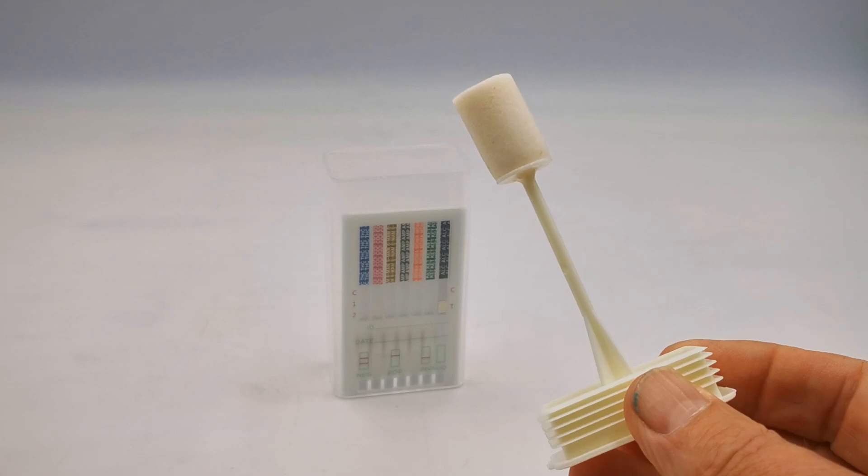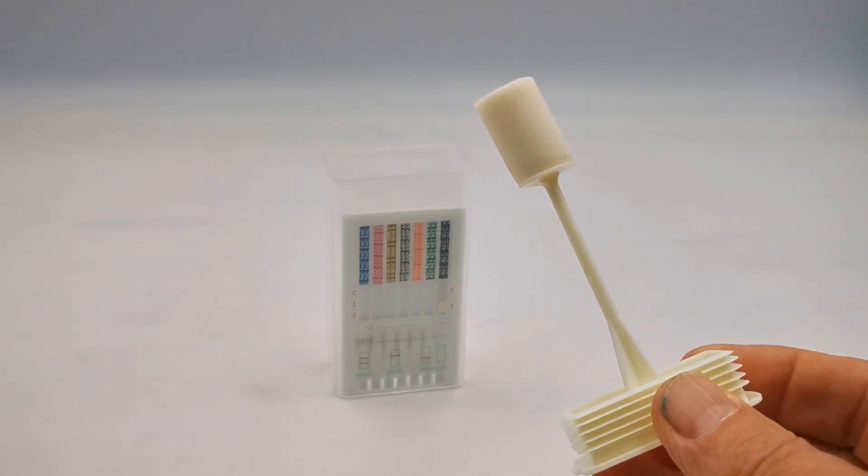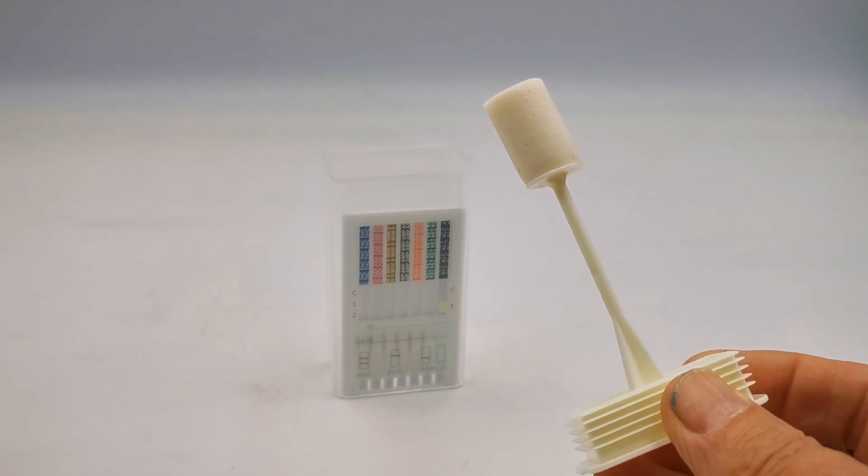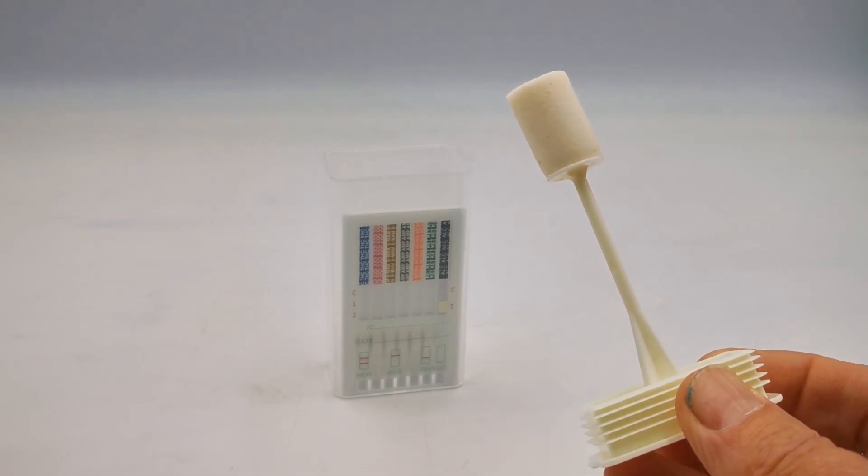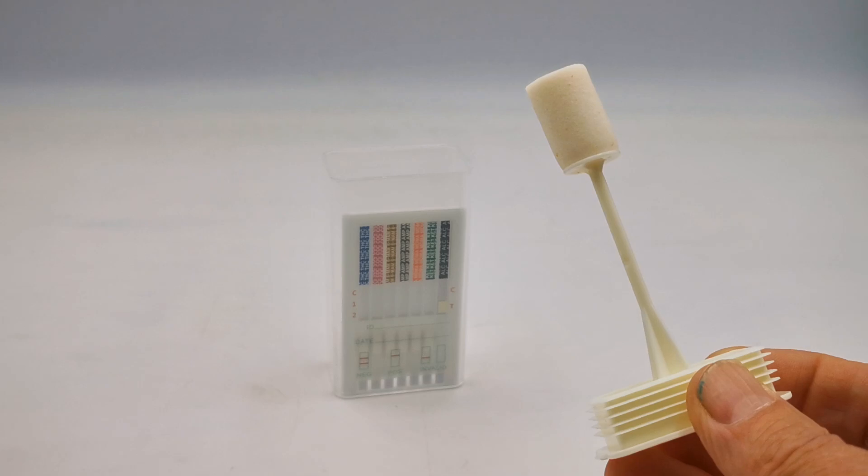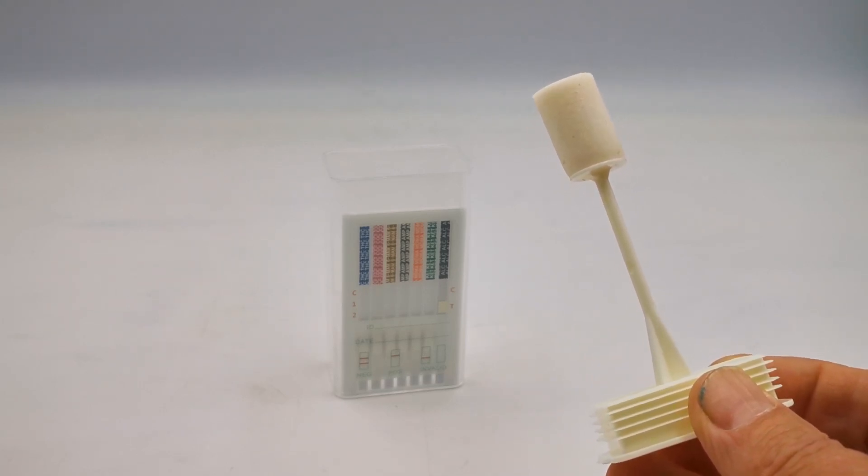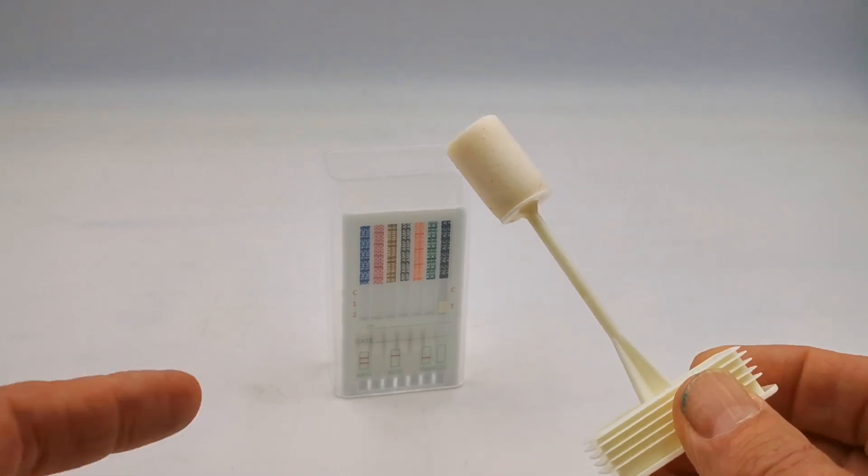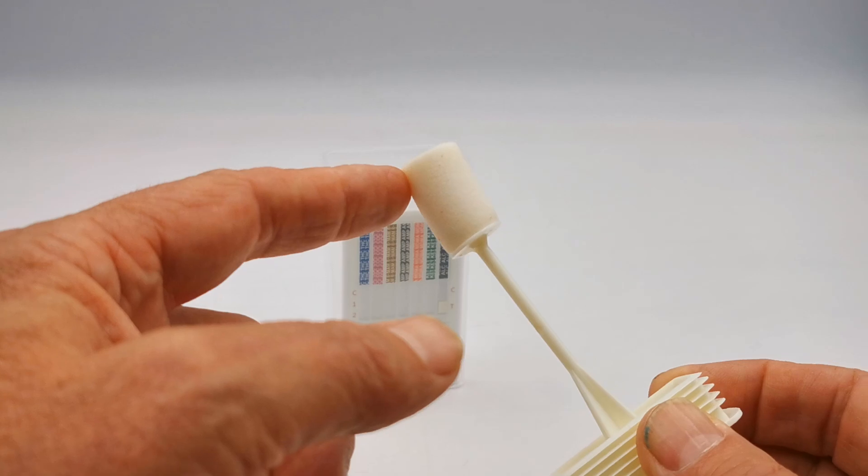This swab has been all around the mouth for around two to three minutes. Don't rush the collection of the saliva sample and make sure that you rub it really well on the buccal membranes and inside of the mouth all around, very gently but very comprehensively to collect any deposits of drugs that are still in the oral cavity. When it's done it should be soft and quite squishy.